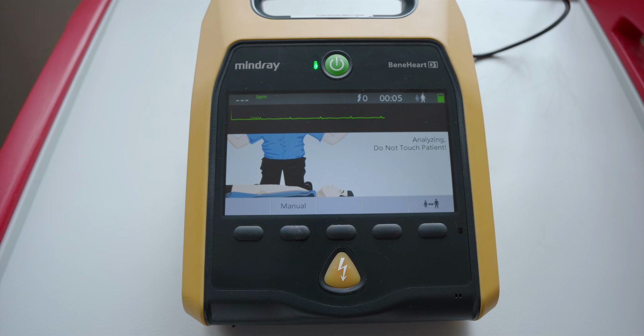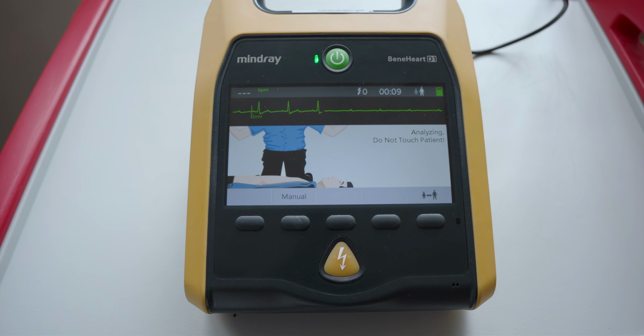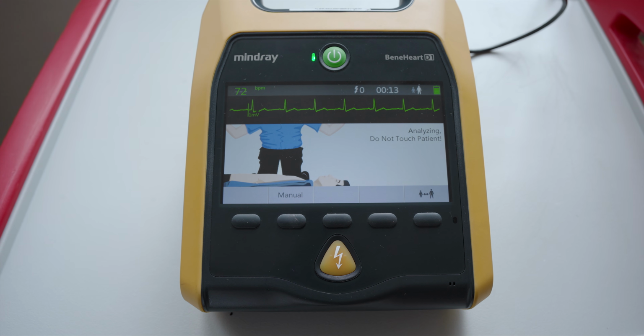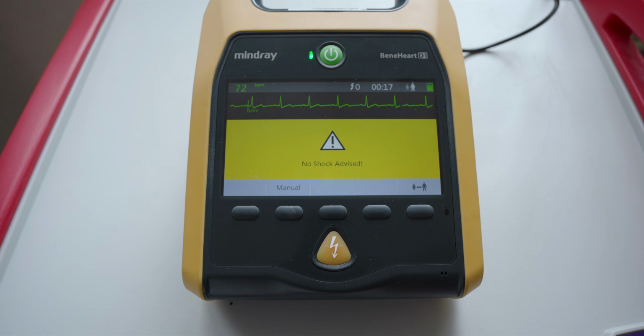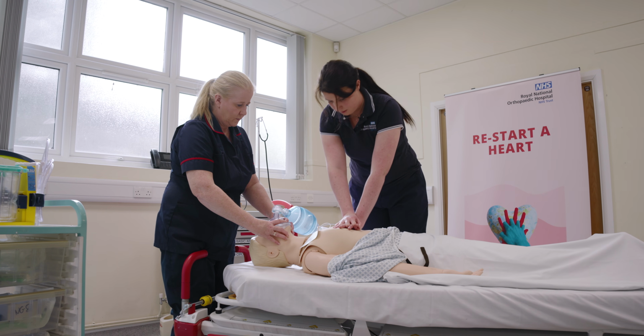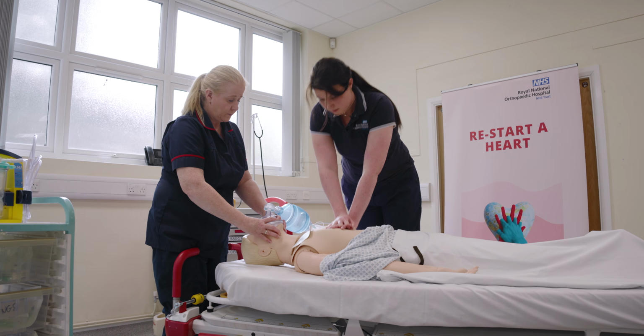Some rhythms are non-shockable. When you turn the green light on the AED, it will still tell you the same commands. Stop CPR and analyse the rhythm. If it is a non-shockable rhythm, the machine will tell you to recommence CPR immediately at a ratio of 30 to 2. You will then need to think about giving drugs such as adrenaline.